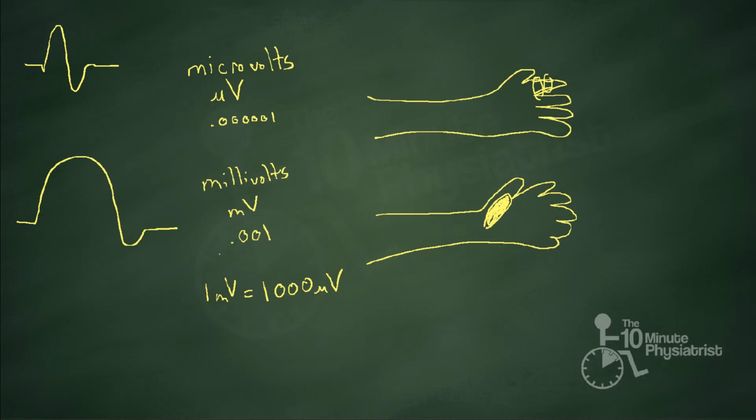So as a general tip, if you are going to include motor nerve and sensory nerve conduction studies, why not start with the motor study? Why not look for the Empire State Building first? Very easy to get, much easier to elicit than a sensory conduction, and it gives you a chance to get the patient at ease, make sure your machine and equipment is working properly, instead of chasing after the much smaller potential. So a little bit of a practical application to that size issue.